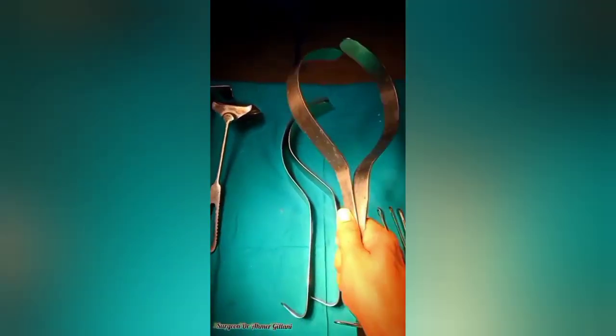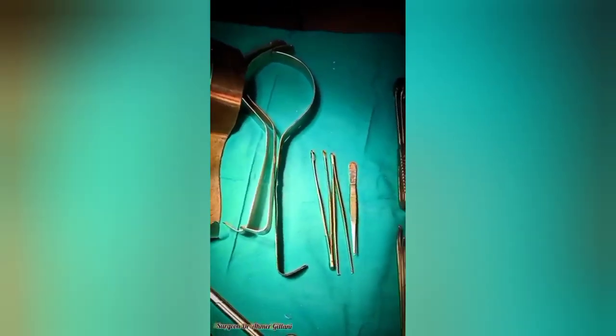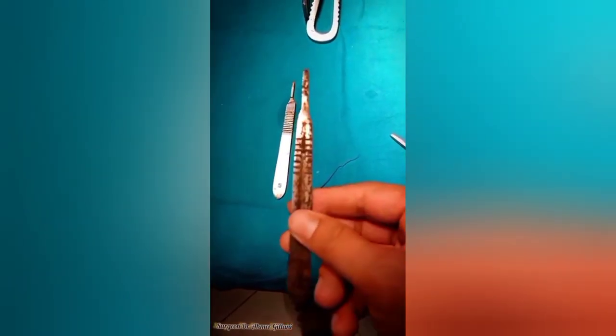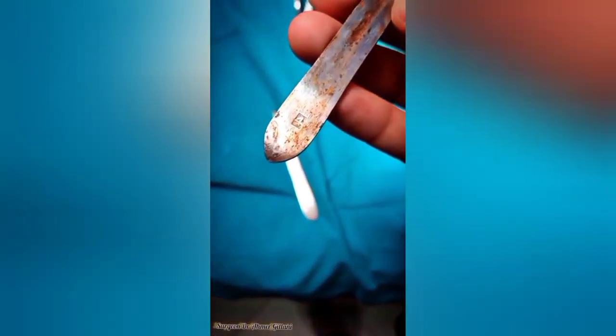Then we have the Deaver retractor, basically used to hold back the abdominal wall during abdominal or thoracic procedures. It may be used to move or hold organs away from the surgical site, especially during cholecystectomy. Next is the BP holder, which is used to hold the knife. It is of different sizes and is named after two persons — Bard and Parker — which is why it is known as the BP holder.